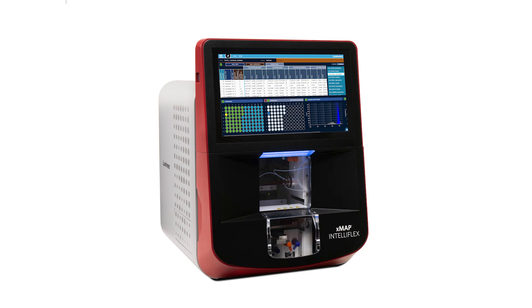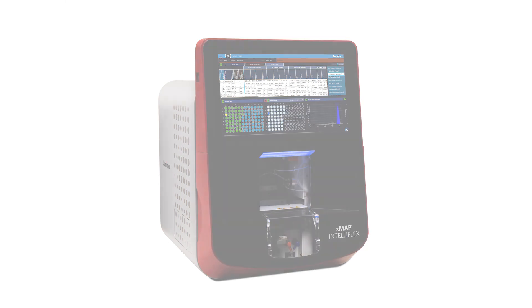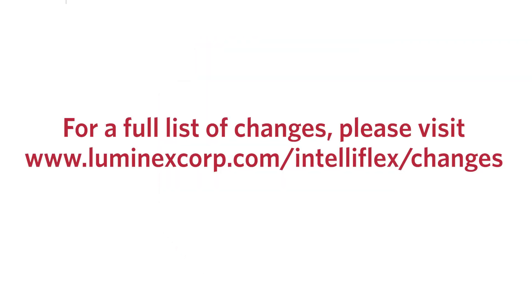We will walk you through the new features available in Version 2.0. For a complete list of changes and features, please visit the luminexcorp.com IntelliFlex website.